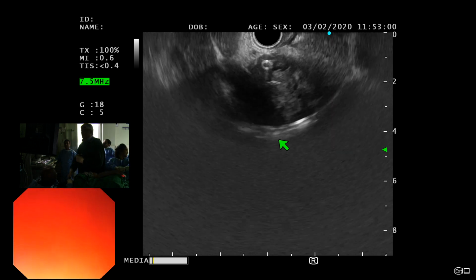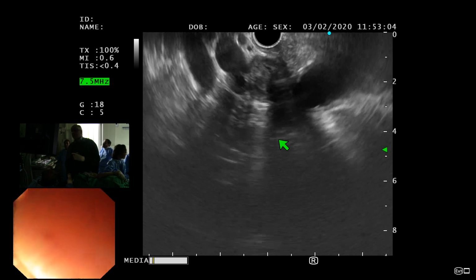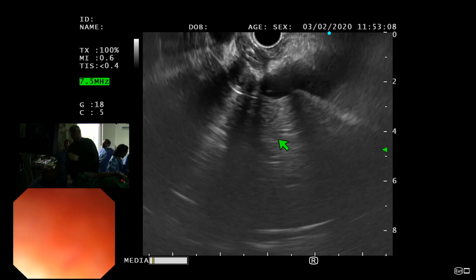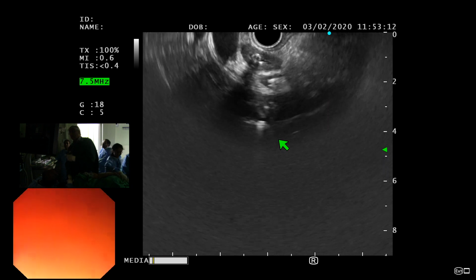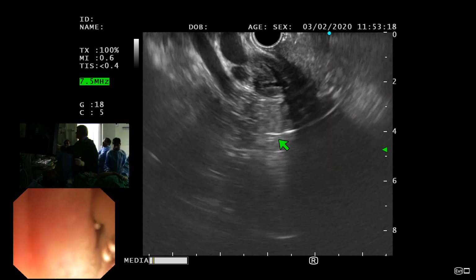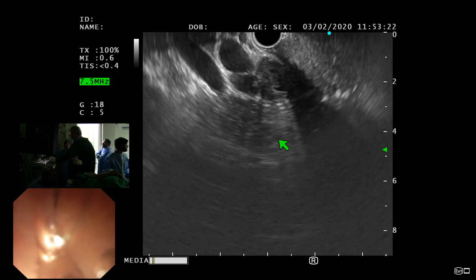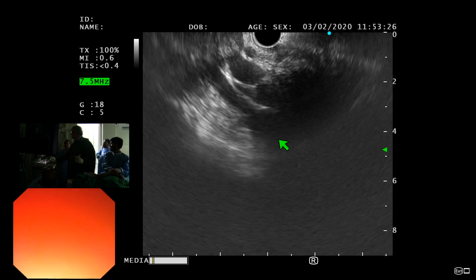See the stent, if I follow the stent all the way, the stent comes down here, and that stent is up there. See the stent comes down to this ductal thing that joins what I was telling you. We lose the vision here, but I'm not sure why that is. But I think I can see a trace of the stent that you are showing now.